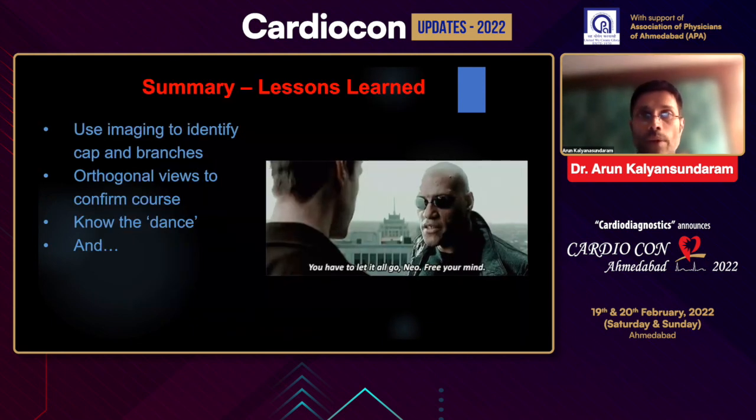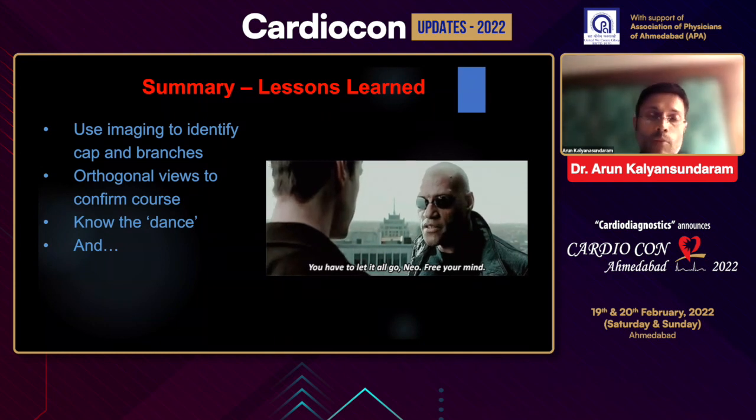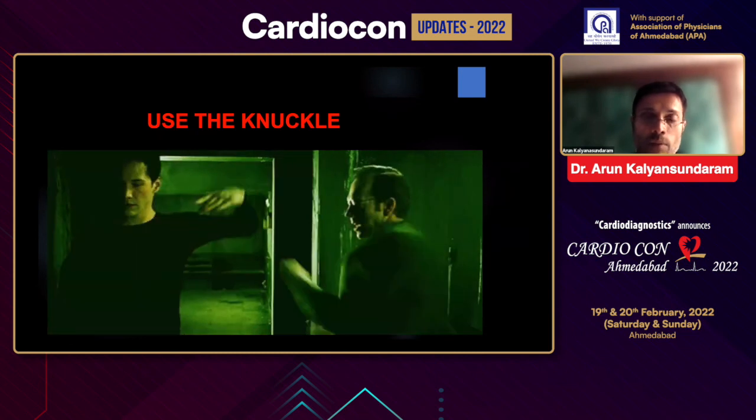So what I really want to emphasize is, have a low threshold for using imaging, IVUS especially, to identify the cap, branches, etc. Before you advance gear, make sure you know where you are so that you don't create a huge perforation. Understand what it means when we talk about dance, etc. And most importantly, use the knuckle. It can save you many, many times.